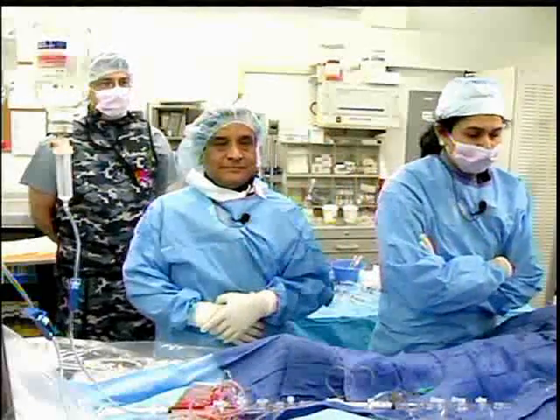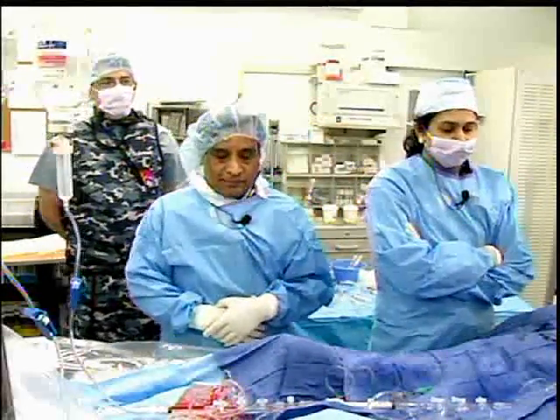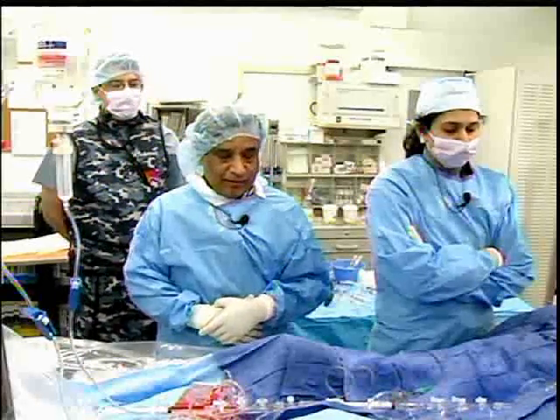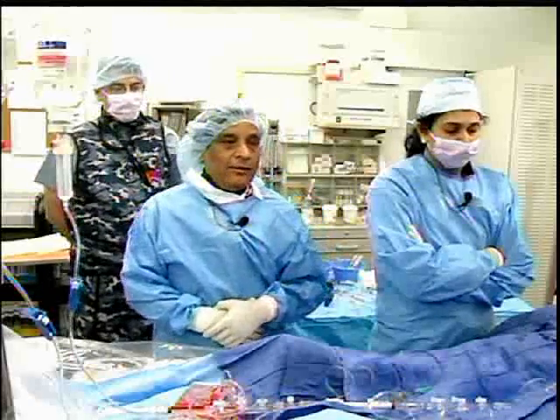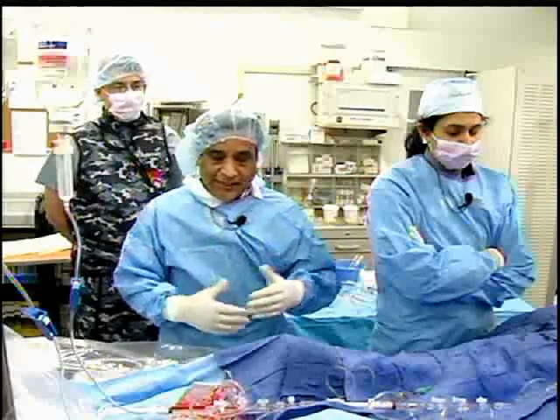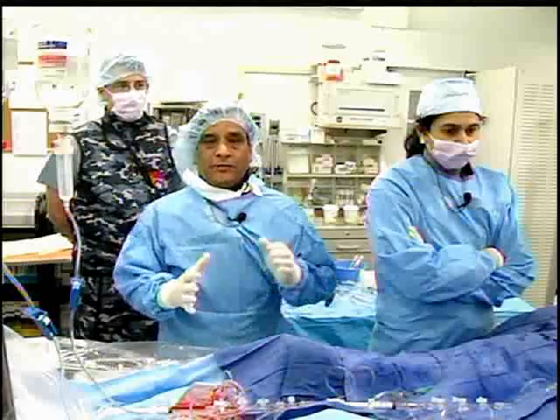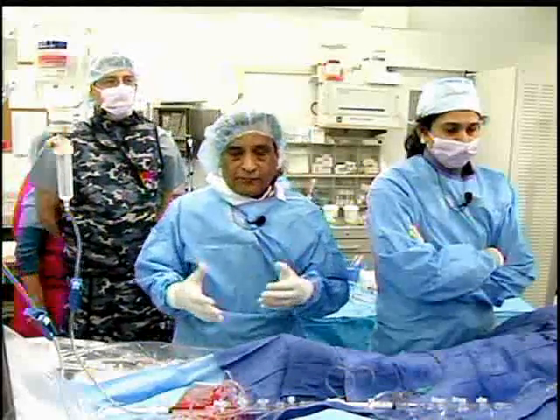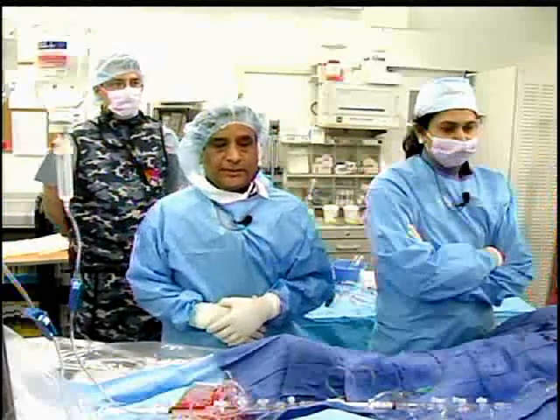Good morning, Sameen. You have Bill Lombardi with you. Good morning, and of course good morning to all our participants who are logged in. The last seven cases have been on the complexity of calcification, angulation, and left main. We got a few emails about total occlusion, so we have selected a patient for total occlusion this time.